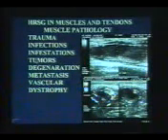And then tumors, evolution of the tumors, degenerations, metastasis, vascular masses mimicking, and of course muscle dystrophy. All these things we can find out on ultrasound using 5, 7, 10 or at times 12 to 15 megahertz, depending upon the location and site of the pathology.